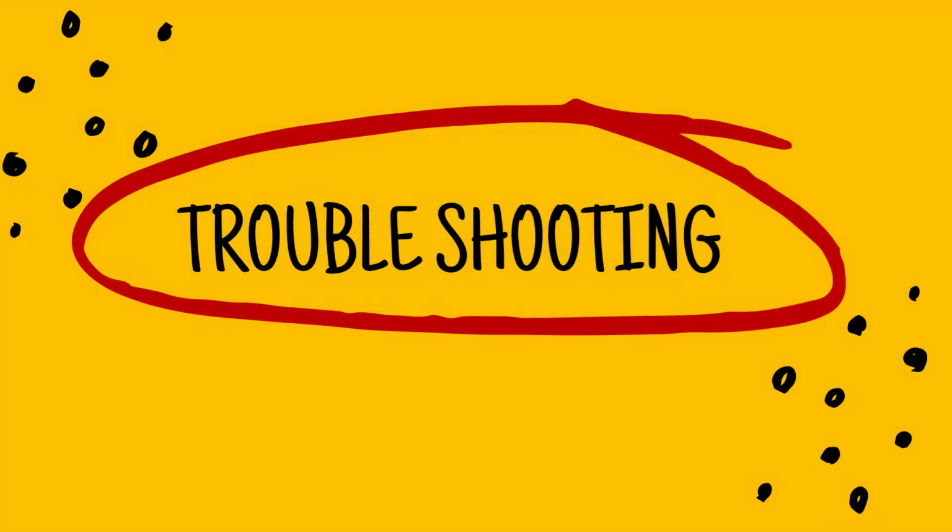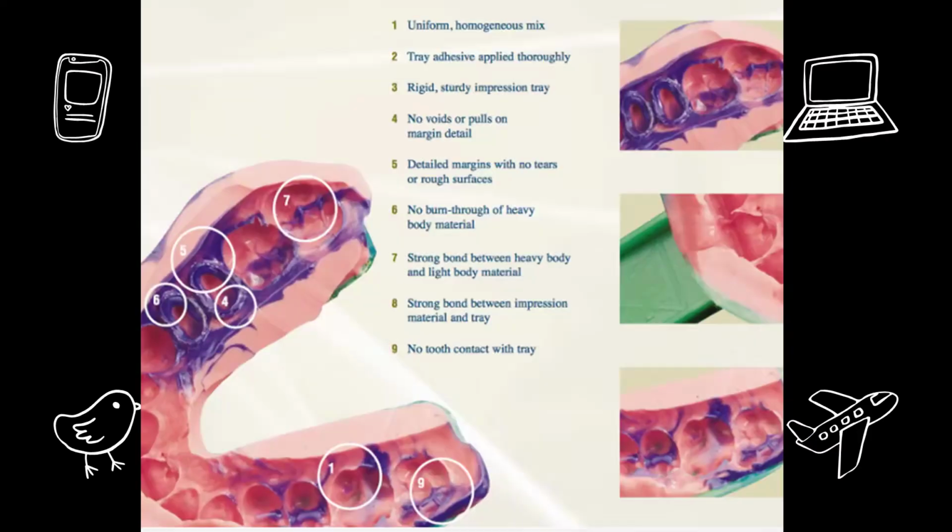Now, let's have a word on troubleshooting as well. Make sure any impression that you record has satisfied the following criteria. The impression material should be uniformly, homogeneously mixed. You should have applied the tray adhesive uniformly and thoroughly. The impression tray should be rigid or sturdy. There should be no voids or pulls on the margin detailing. There should be detailed margins with no tears or rough surfaces. No burn through of heavy body material.